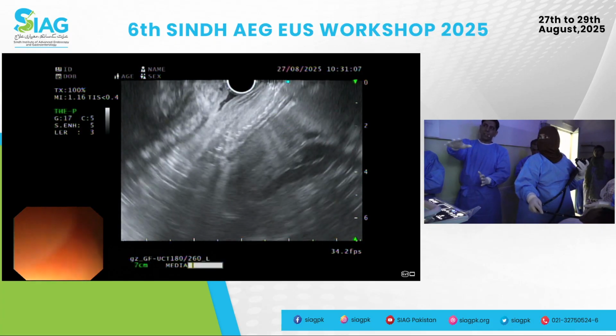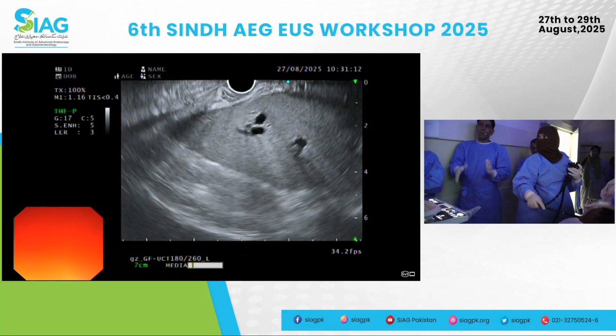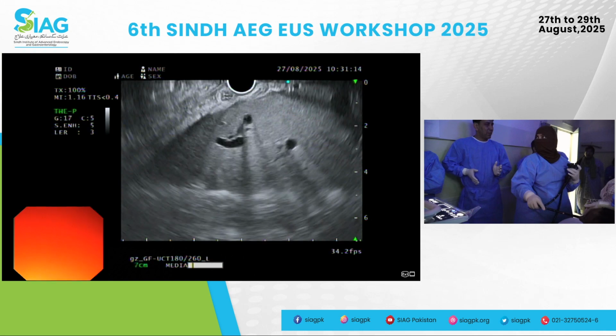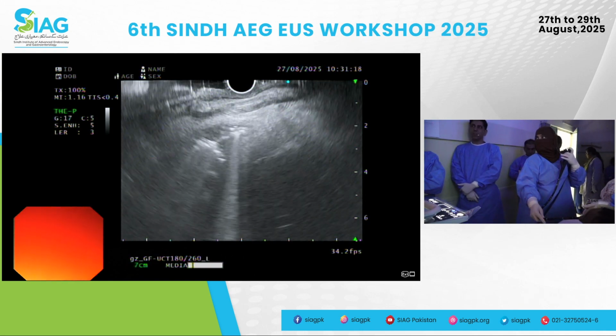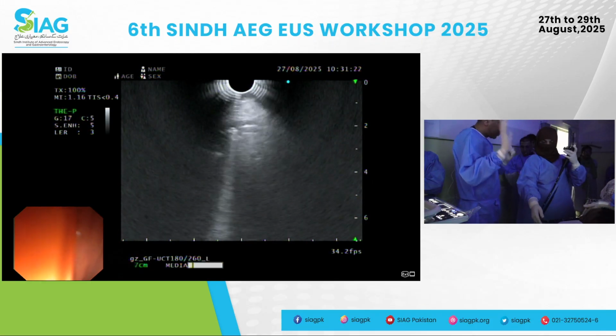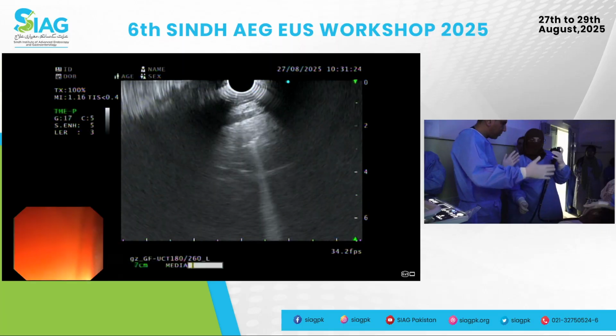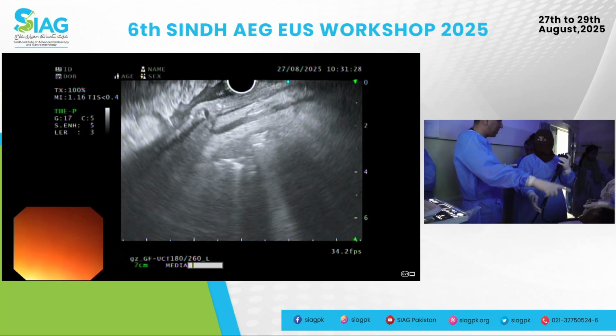You can, but obviously you can, at the same time, scan the plane and just slowly rotate. So if you're not going to go from the patient's right to the posterior, okay, good. So clockwise rotation, good. So the other thing, I'll stop you there. Okay, exactly. So just remember, you need to step back a bit. Make sure every movement that you're making here, you're able to transmit exactly.